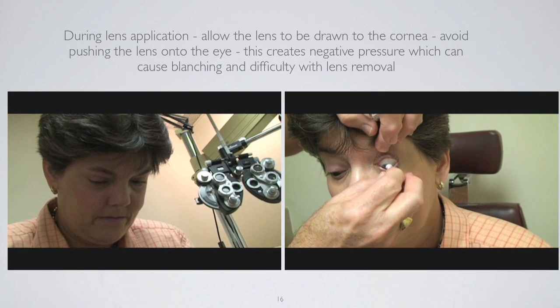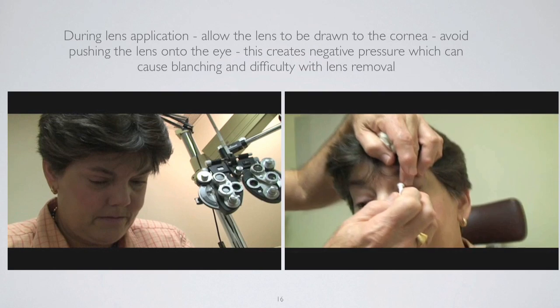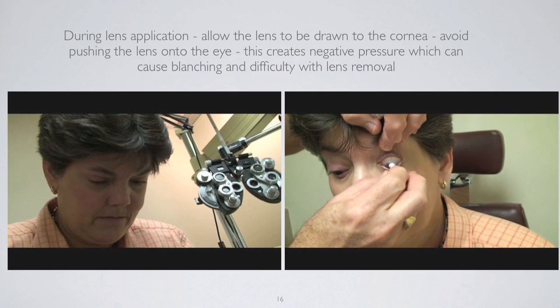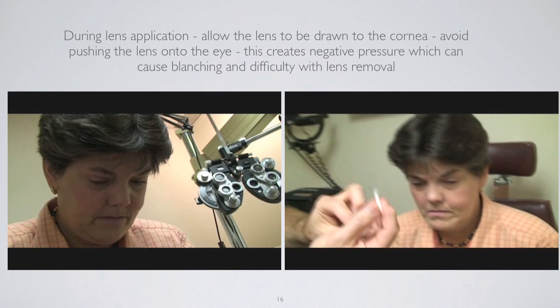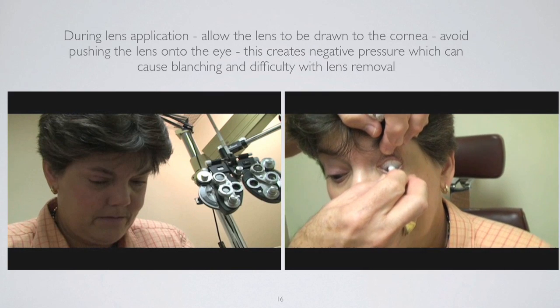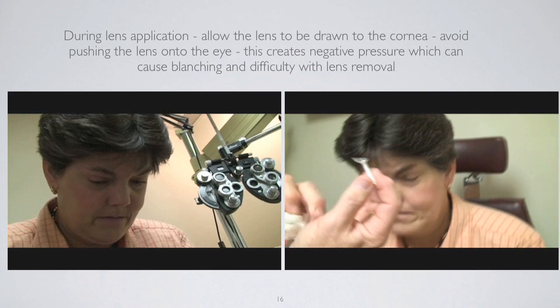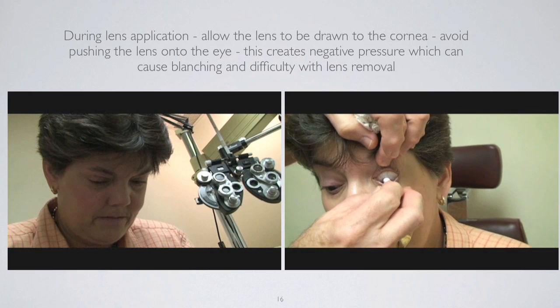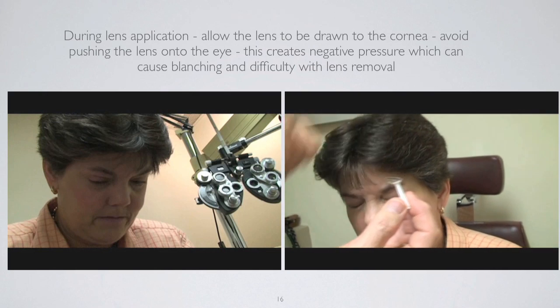Now I'm going to remove the lens with the small DMV device. I get the lens towards the edge and just lift out like I'm opening up a cabinet door — using that motion of lifting away from the eye, getting the device at the mid-peripheral portion of the lens so that I don't have a plunger effect but am actually lifting the lens off the eye.